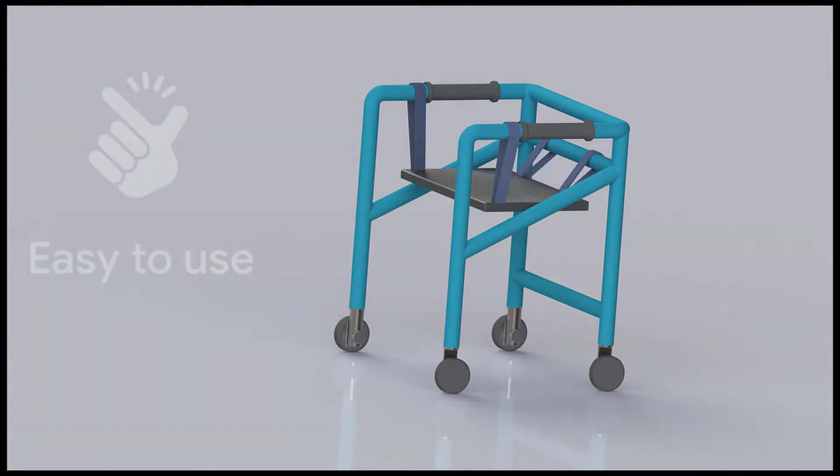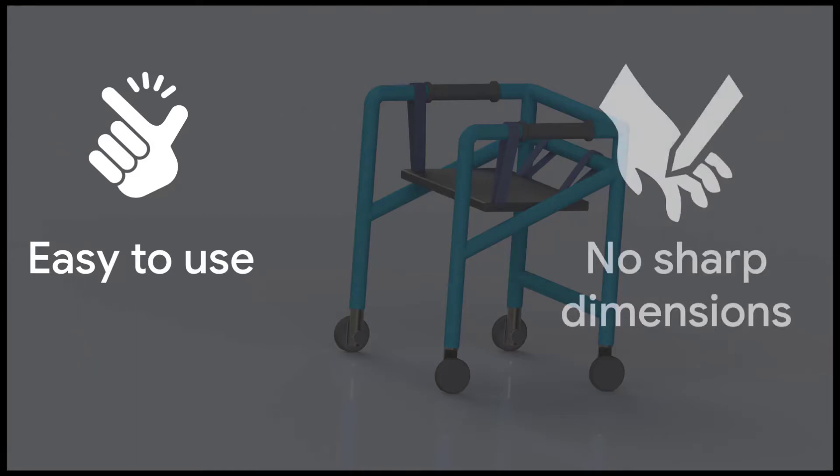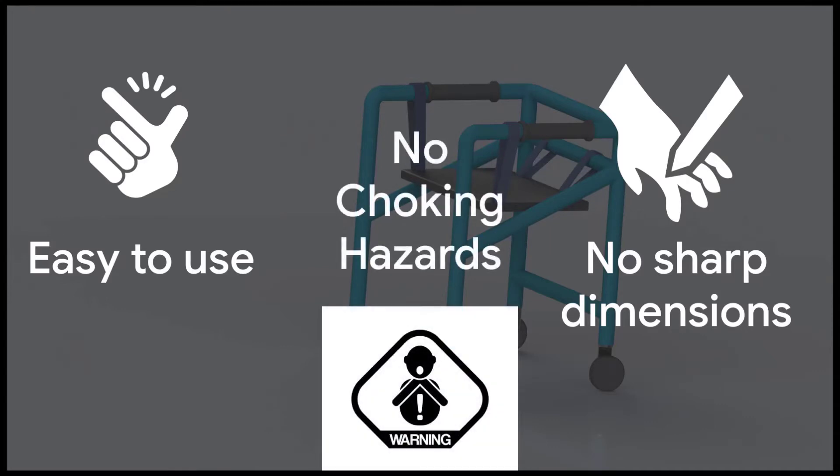With this in mind, we wanted to design and create a well thought out walker that could be easily used by a family that has a child with cerebral palsy. We made sure to keep safety our number one priority, ensuring that any rough or sharp corners were rounded out to be a smooth surface. We also wanted to reduce pieces that young children could possibly choke on or pinch themselves on. And of course, we had to make sure that the design could support up to 35 pounds of weight, as we wouldn't want it to collapse when in use.